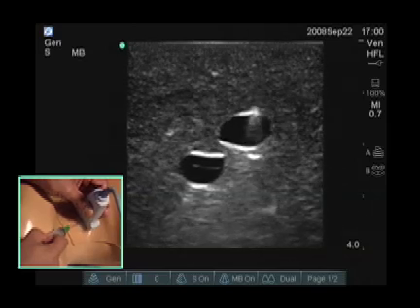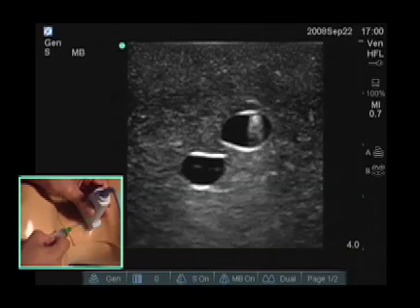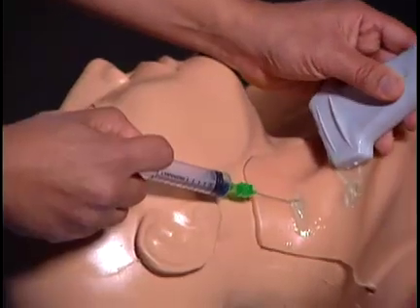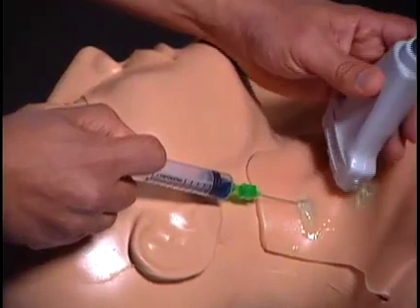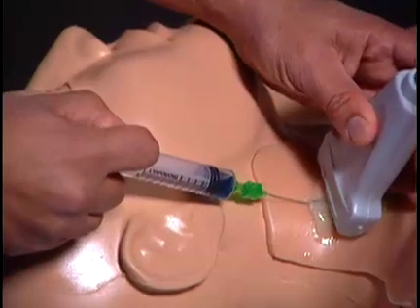You can see I'm getting closer to the vein now — and I've actually hit the vein. If you can get a close look here, you can actually see a little bit of blue liquid, which demonstrates that I've actually hit the vein.